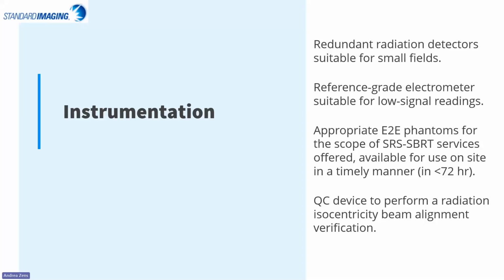MPPG 9A provides a list of essential instrumentation needed to complete a variety of QA tasks.